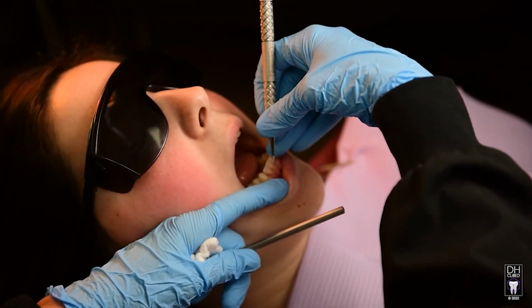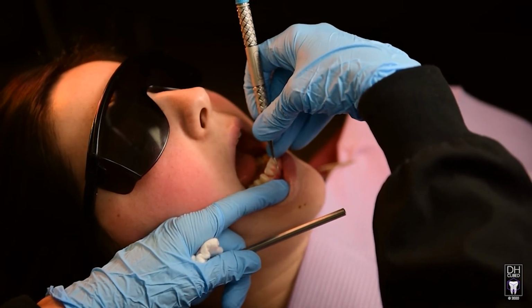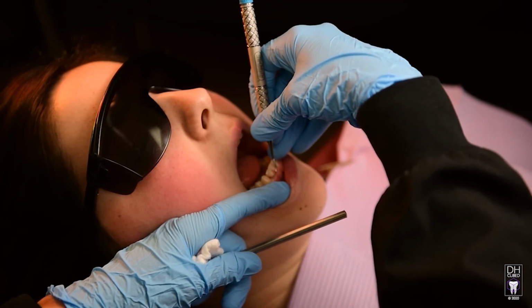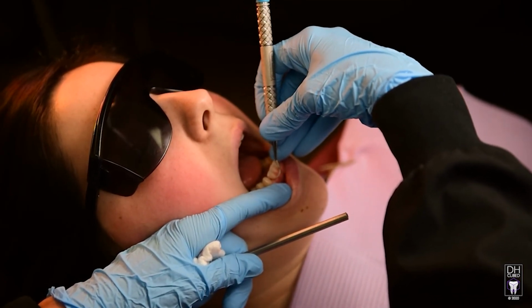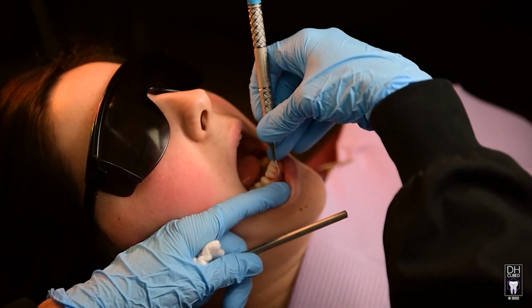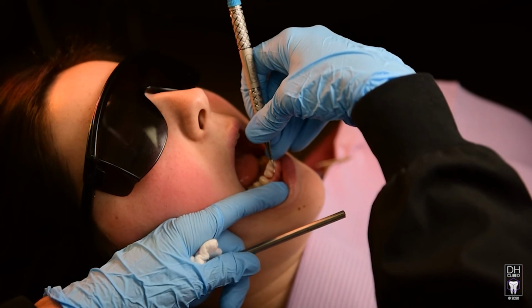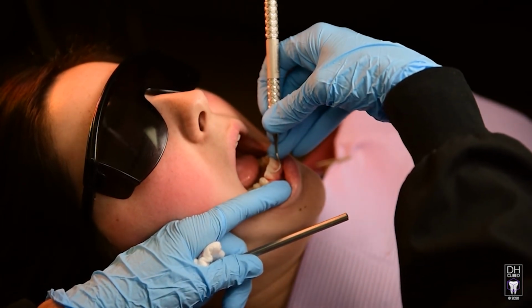When sharp, the instrument can give you tactile feedback of the root surface. You can be using such a light stroke, like an exploratory stroke, and be scaling the root surface. Very little pressure is required for the instrument to be removing calculus and root roughness. You can see how the hygienist is using a lighter stroke, not pressing so hard. And you can hear the sharp instrument against the tooth surface.